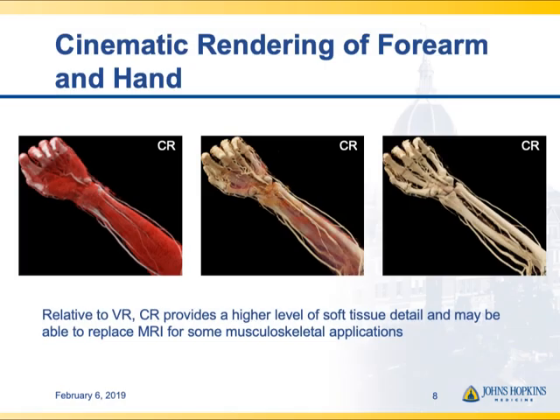Here's an arm, and as you can see with cinematic rendering you can show a variety of different tissues depending on how you've windowed your settings. You can show soft tissue, muscle, and skin very well. Contrast-enhanced vessels show up really well, and bone shows up particularly well — a very high contrast material where you can see very small detail.